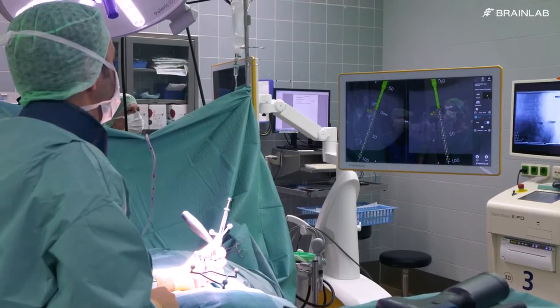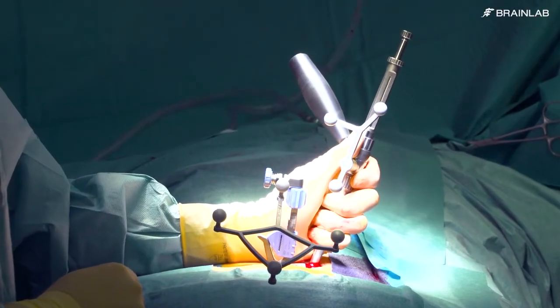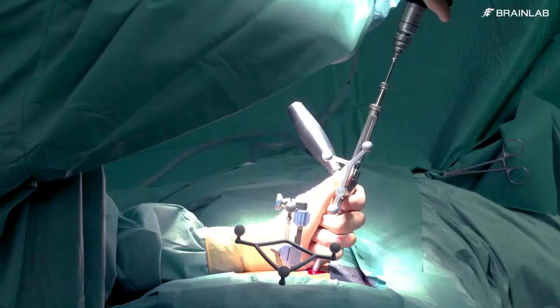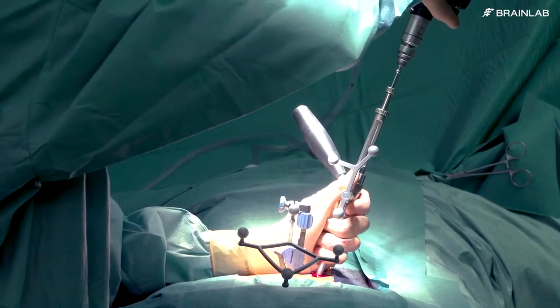This facilitates the entry of the drill guide and the approach towards the preferred anchor point on the bone surface. Once the optimal trajectory is determined, a drill is inserted through the guide to drill the pilot hole. The depth control can be adjusted to precisely define the maximal depth.